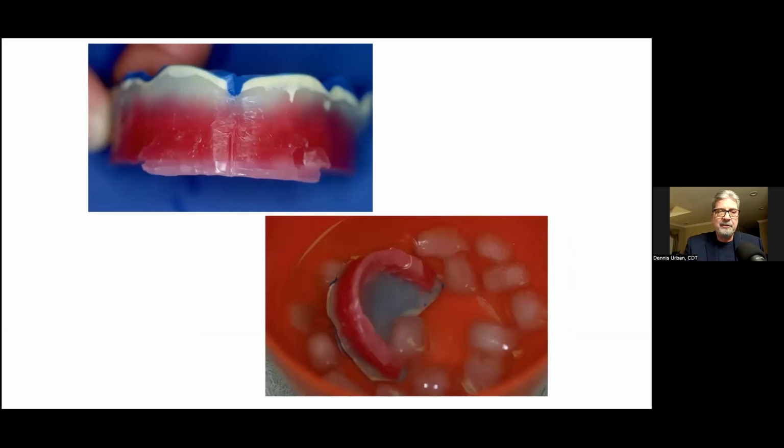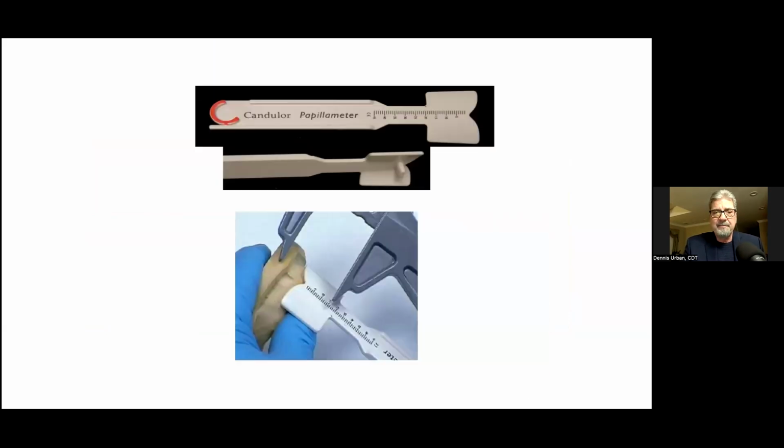In this particular photo, the doctor added some wax to the incisal on the upper left-hand side, so I know exactly where that incisal edge should go when I set my denture teeth.